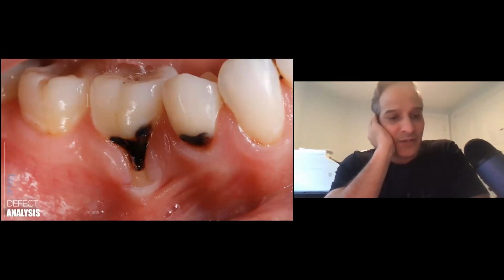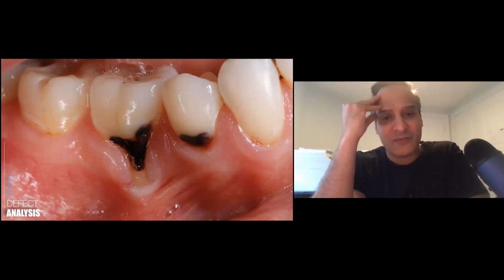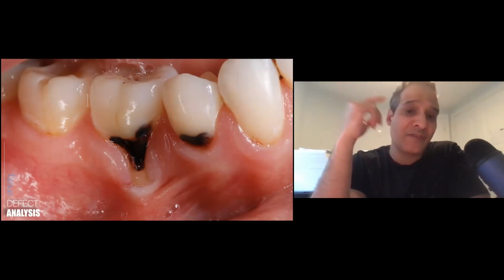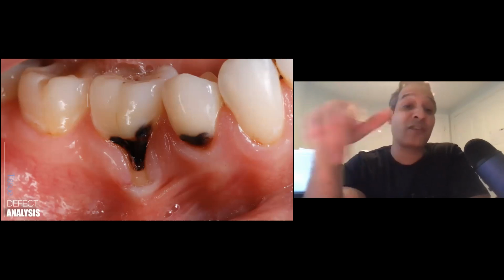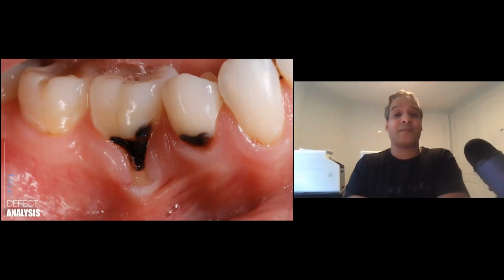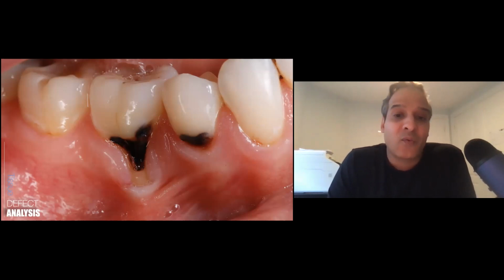Some dentists I talk to don't even know that we can do this. Remember, whenever you have connective tissue, it can attach on cementum. So in a case like this, even though there's decay, you don't need to put a restoration there. She actually came to see me first because she was worried about the gums, and then I referred her to a dentist once we took care of her. In a case like this, I remove the decay first.